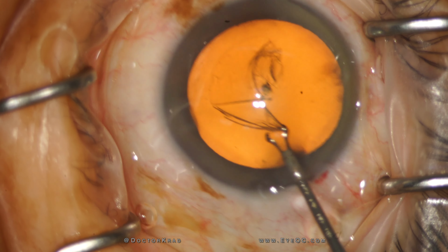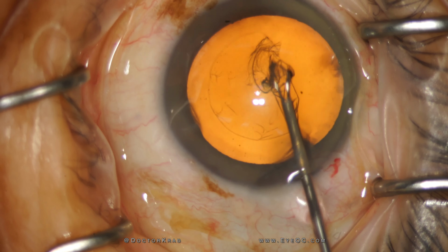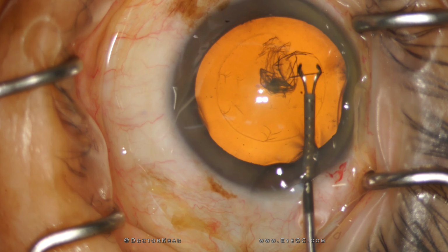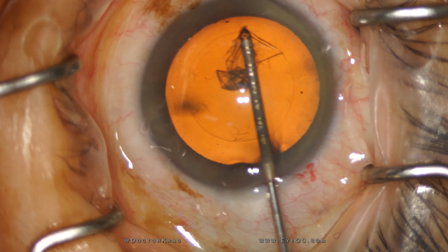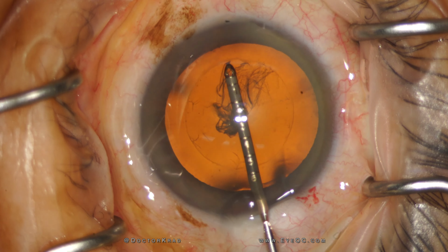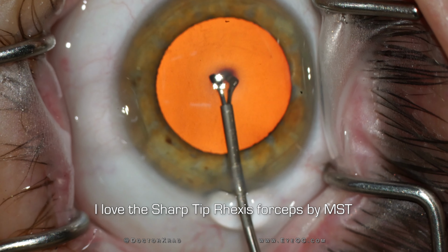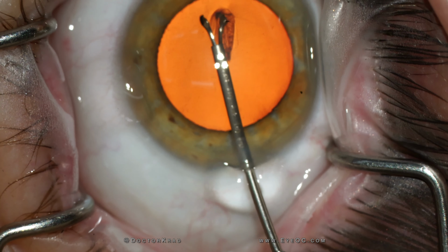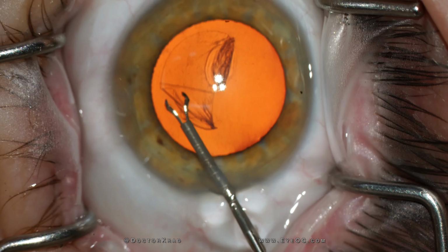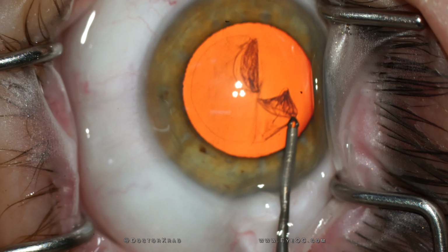Today I'm going to talk about the manual capsulorhexis and share a few things that have helped me along the way. There are many different ways to perform the capsulorhexis. Some surgeons use a bent needle or cystotome, some use forceps, and some prefer laser or Zepto. Today, I will focus on the manual capsulorhexis, and the following are 30 RHEXIS tips to hopefully help you level up your capsulorhexis.